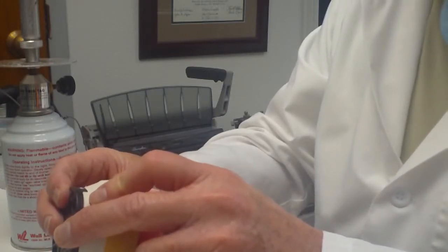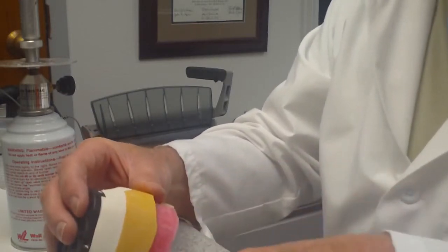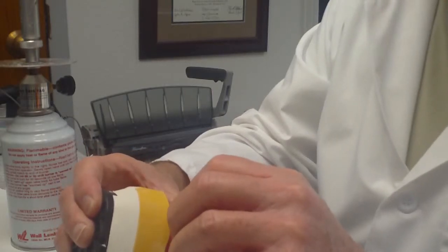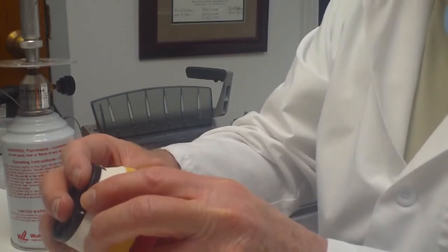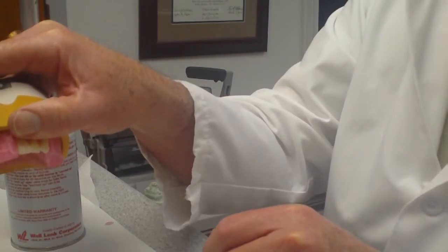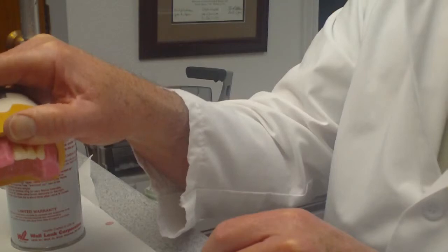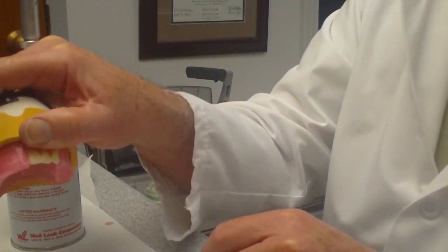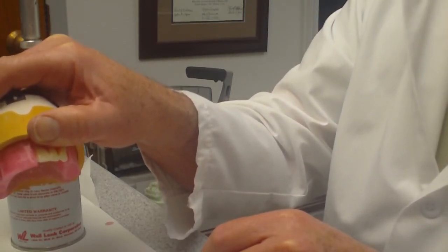Again, positioning the canine really helps determine where the posterior teeth are going to begin to be arranged. And so you can take a look. I've kind of got my thumb over it so that the wax itself isn't a distractor, but at least initially this seems like a relatively reasonable positioning of the teeth. So what I'm going to do is tack these teeth into place, and then we'll go ahead and move on to setting the opposite side.